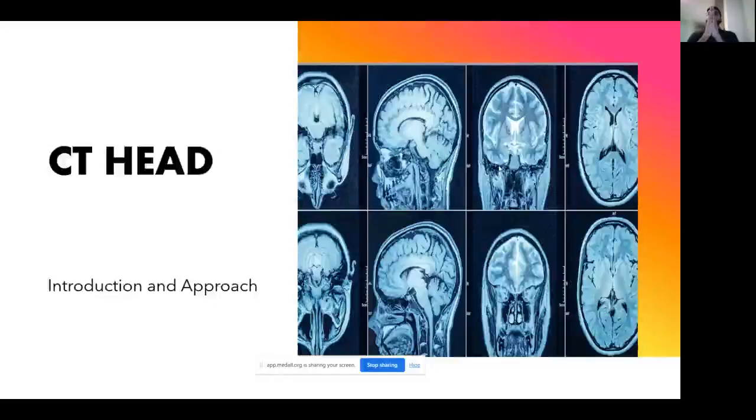Now we have quickly gone through the basic things that we need to know about CT scans. Most important, X-rays are absorbed differently by different tissues. And that is why we have the Hounsfield unit. Remember, Hounsfield unit helps us to differentiate different tissues. Remember about windowing, which helps us to narrow and focus on a single window, say bone window or lung window, which helps us to focus on that tissue alone to help us get more information. And remember about contrast and different phases, the arterial phase, the portal venous phase, and also the orientation about your left being the patient's right and your right being patient's left whenever you're looking at a scan.